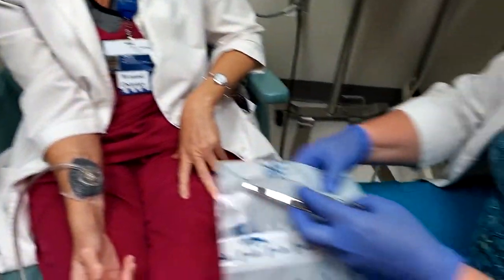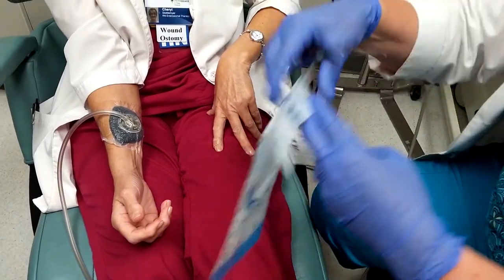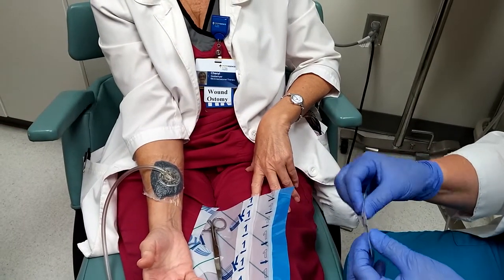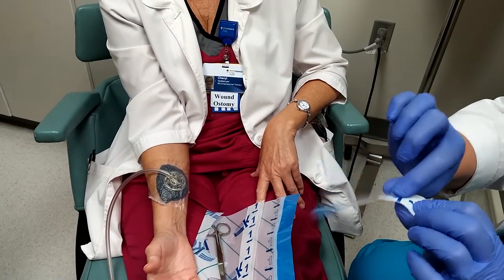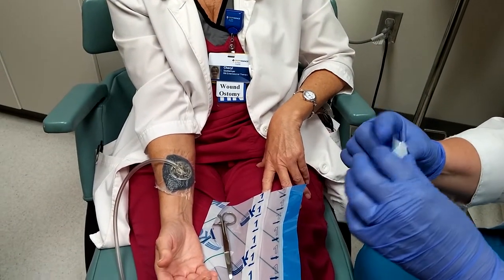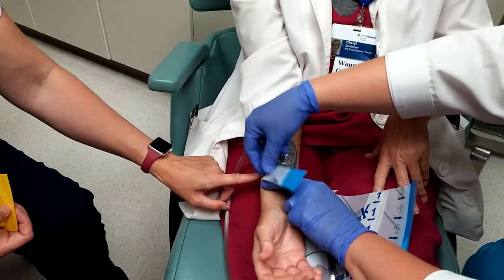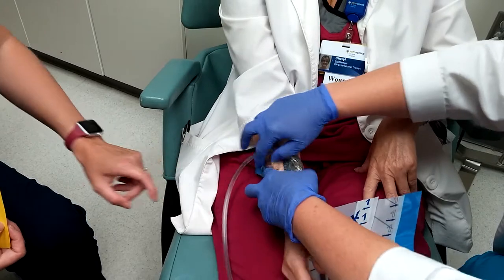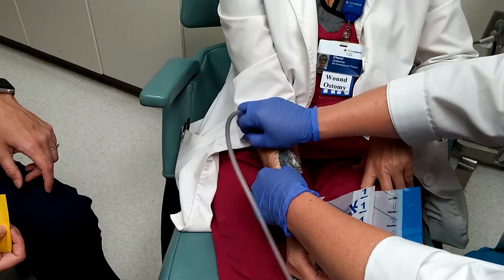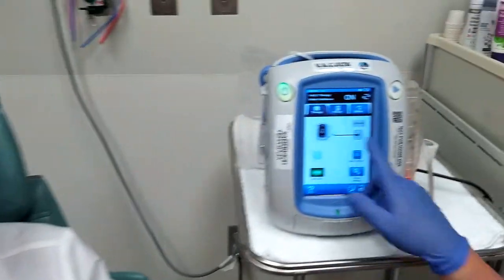This is like a seal-a-meal. To patch a wound vac, there's usually extra drape somewhere in the room; if not, Tegaderm does work. There's a one side, a two side, and the blue — one, two, and blue. Take the one off first, and just like a seal-a-meal, take the edge that's up, take the one side, then the two side, then the blue. And that seals it right down and you've got a good seal again.